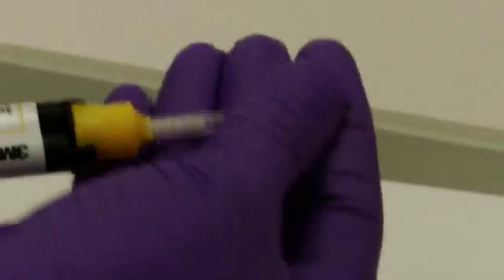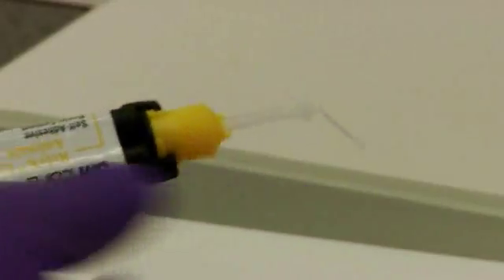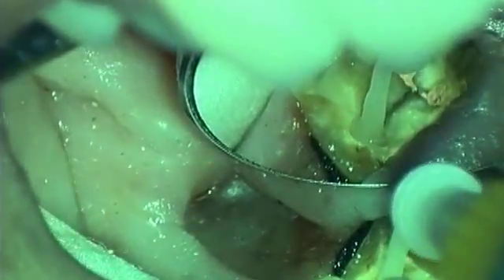Attach an endo tip to the wide mixing tip for application in the root canal. Insert the endo tip as deeply as possible in the root canal and, beginning apically, apply Reliax Unisem-2 Auto-Mix.